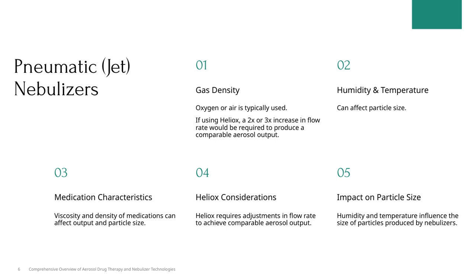But when Heliox is used, the flow rate adjustments I mentioned earlier become especially important to maintain effective aerosol therapy. And speaking of equipment, pneumatic or jet nebulizers are common devices that rely on compressed gas to generate aerosols. Understanding how these variables influence nebulizer performance helps us optimize treatment for our patients.